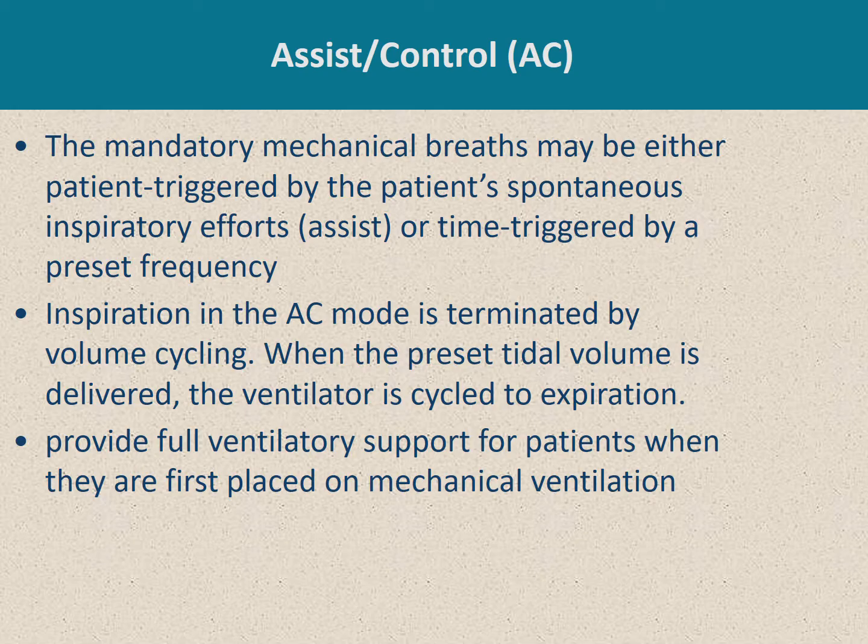Inspiration in assist control is terminated by volume cycling, when the preset tidal volume is delivered. This ventilatory mode provides full support for patients when they are first placed on mechanical ventilation.